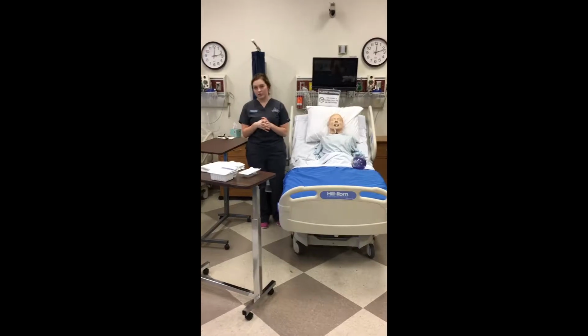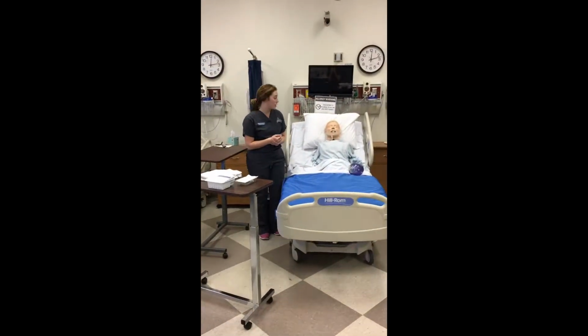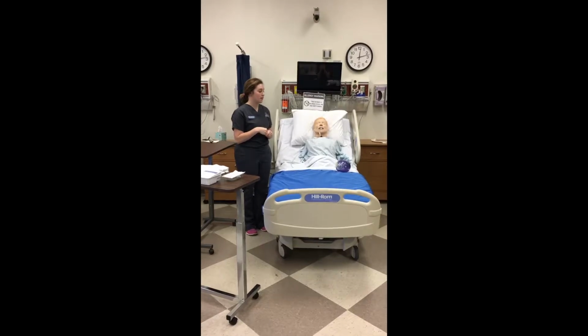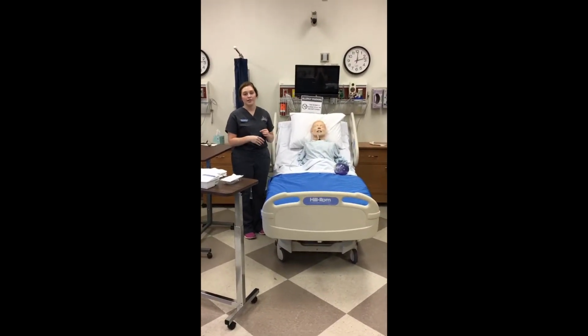After that, you're going to want to assemble your supplies, which I have done. Next, you are going to go into the patient's room. You're going to identify yourself to the patient and then get 2 patient identifiers from the patient themselves. You're going to explain to them the procedure you're going to be doing and then how they can assist you with that.